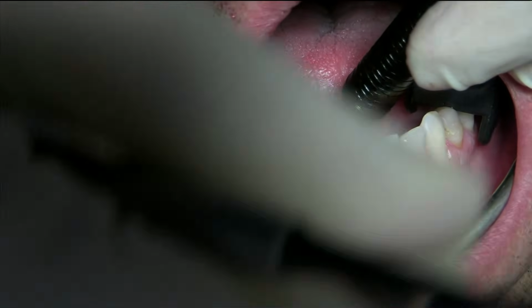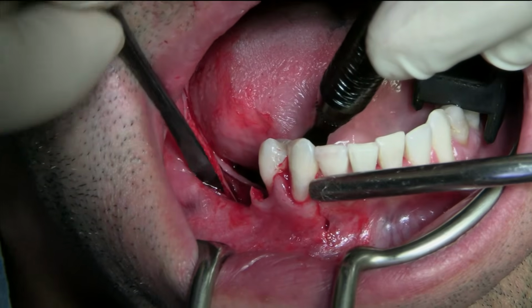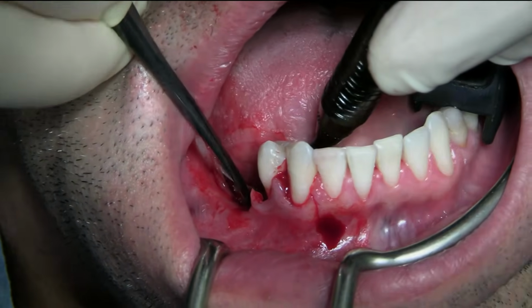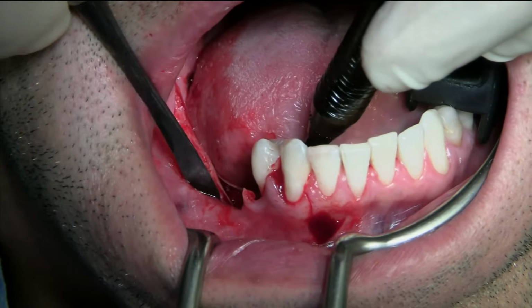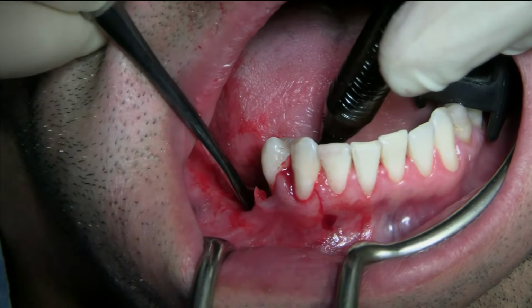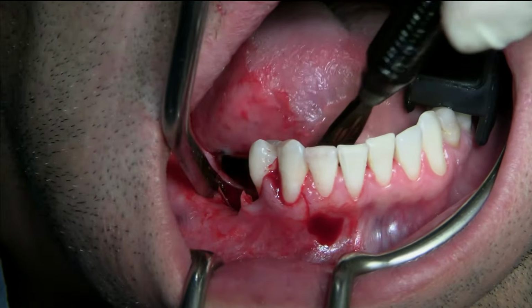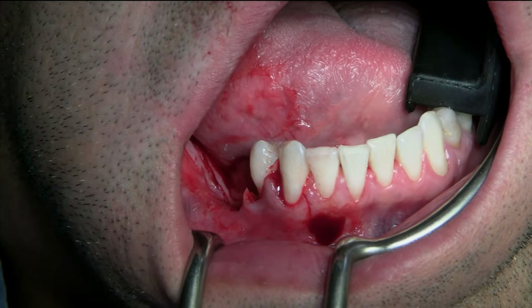Okay, this is bone. I already elevated the part distal of the tooth. Now I just need to get into the part where the old implant was. Where's the plier?